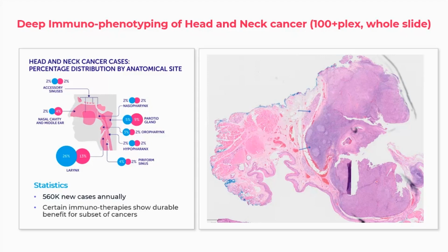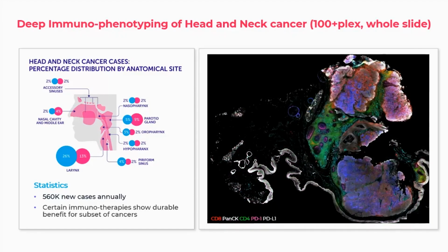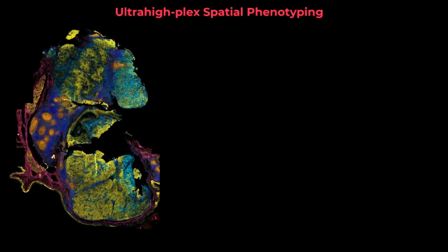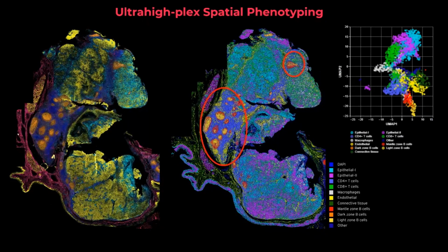So this is an H&E section, and we can look at the cellular architecture directly on the tissue using these spatial approaches. Where it got interesting for us is we can do the multiplex IF imaging, but then based on the co-expression of over 100 markers, we can now cell annotate them into this sort of atlas. What you see in the yellow and red in the middle is normal tonsil, but what you see at the top right is a tertiary lymphoid structure specifically infiltrating that bit of the tumor at the top right.